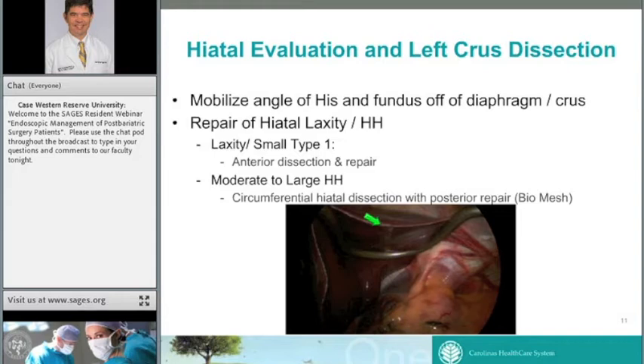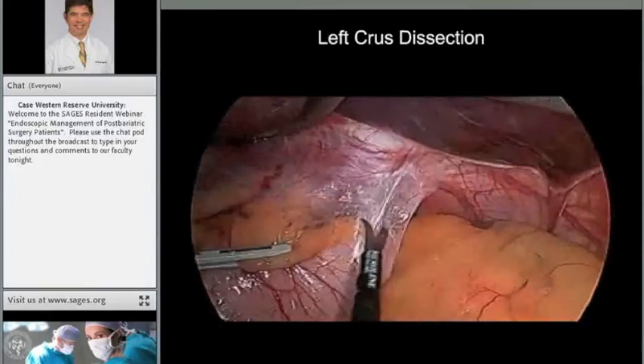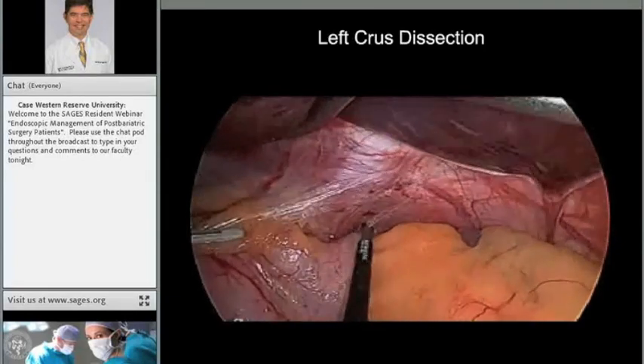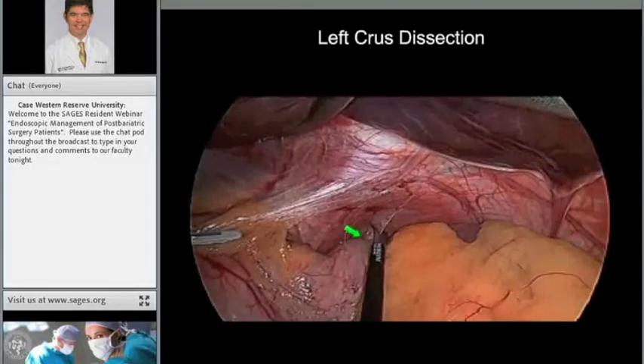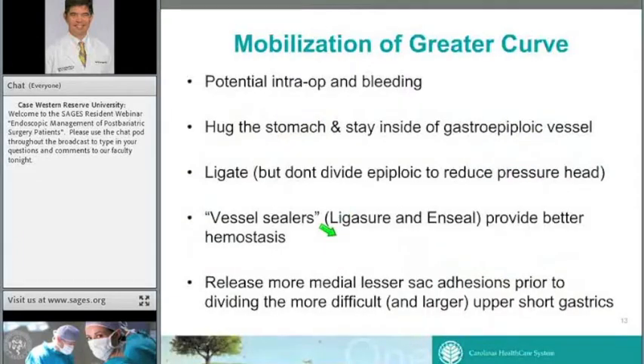For a bigger hiatal hernia, I'll do a full circumferential dissection and repair it just like any other hiatal hernia — with a posterior cruroplasty, often with placement of some type of reinforcing bio-mesh. Next we look at the left crux and angle of His. The first part of the operation involves taking the stomach off the left diaphragm, watching for vessels coursing on the diaphragm. Freeing this up helps when you reach the most superior part of your short gastric division, making that step easier.